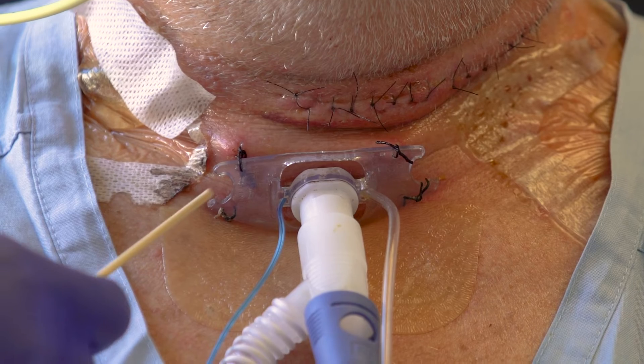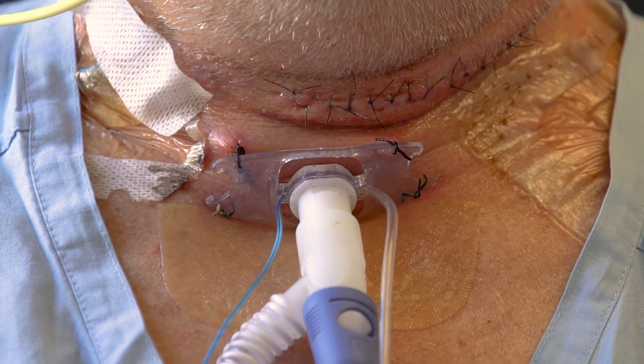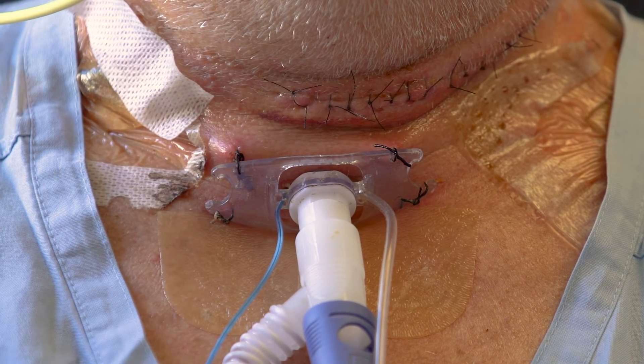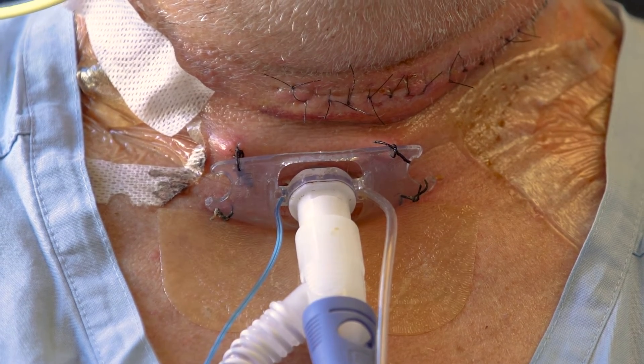Check at the start of each shift that the sutures are intact. The flanges should be appropriately secured with sutures at all four points at a minimum to avoid accidental decannulation. There should be two sutures at the top and two sutures at the bottom of the flange.